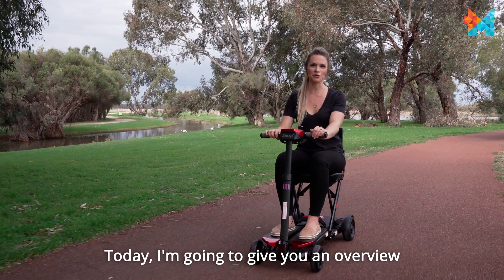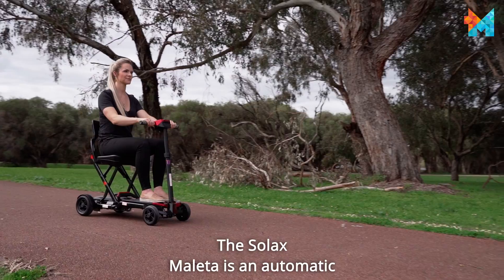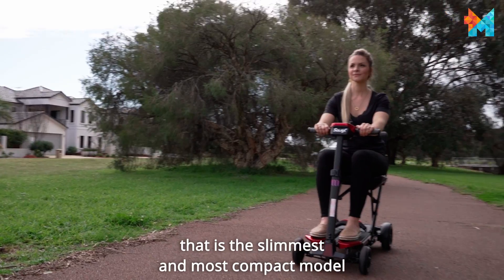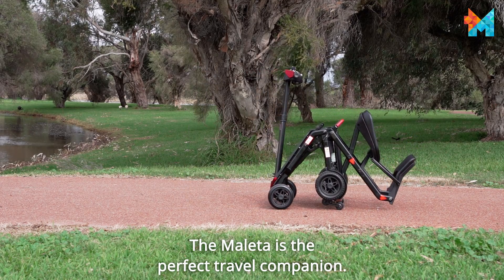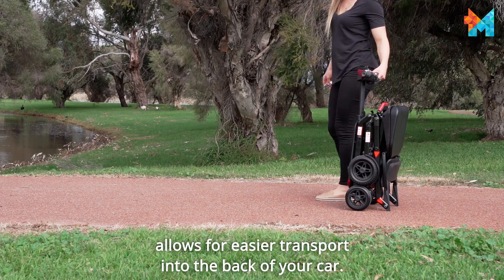Today I'm going to give you an overview of the Solax Maleta. The Solax Maleta is an automatic folding travel scooter that is the slimmest and most compact model in the Solax range. The Maleta is the perfect travel companion. Its slim build and automatic fold feature allows for ease of transport into the back of your car.